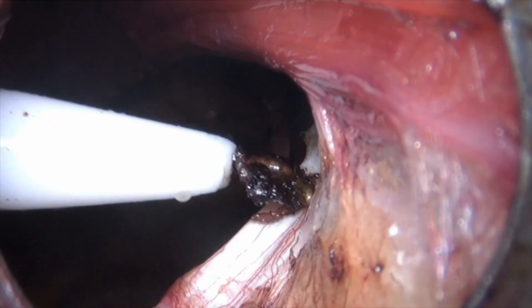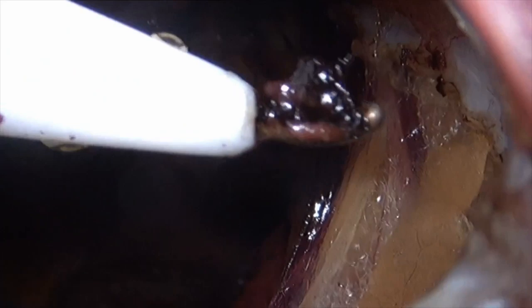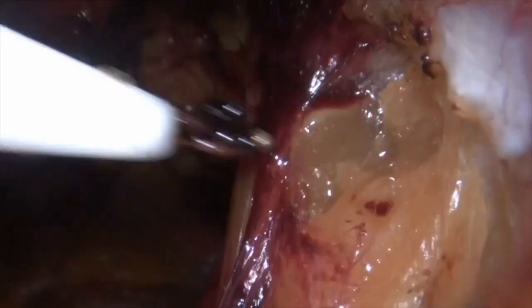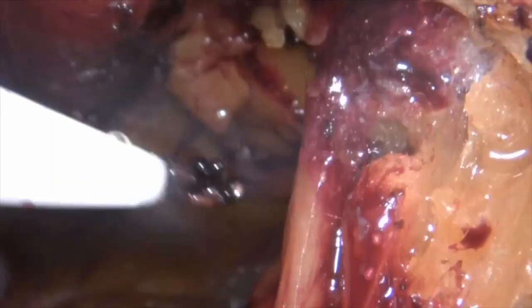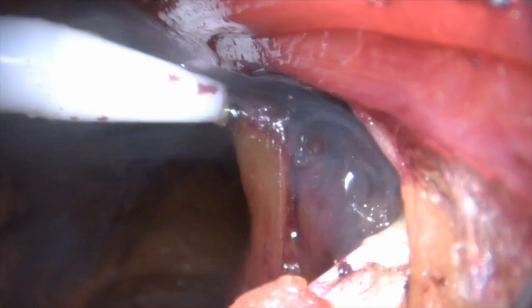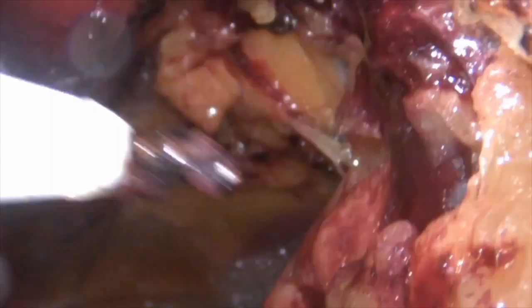So here we're just demonstrating how to incise the posterior rectus sheath. You can see we are incising it in a sharp manner, and we are going to use the cautery also well over there. So now you can see we are able to identify the fat a lot more clearly over the area where we have incised the posterior rectus sheath, and we are just continuing to use the cautery and push the fat down. So again, just a simple monopolar hook is good enough, or you can use a Maryland or scissors as well. It is depending on your comfort. We generally like the hook because it's a low profile instrument and cost effective as well for us to carry out a safe dissection for the patient.